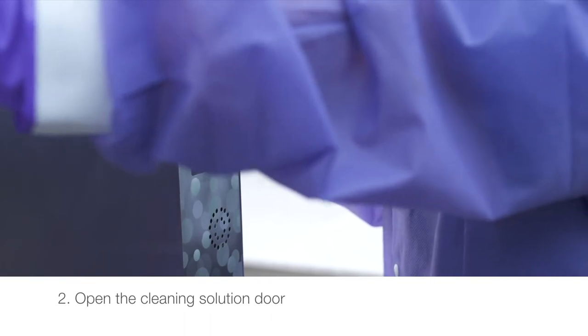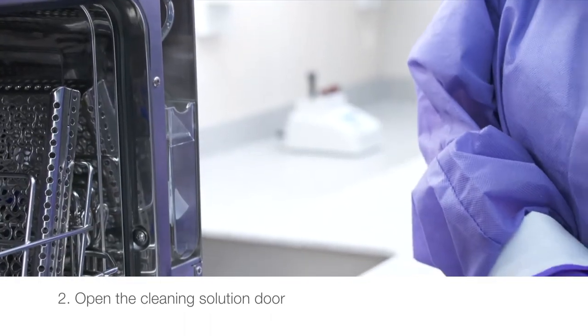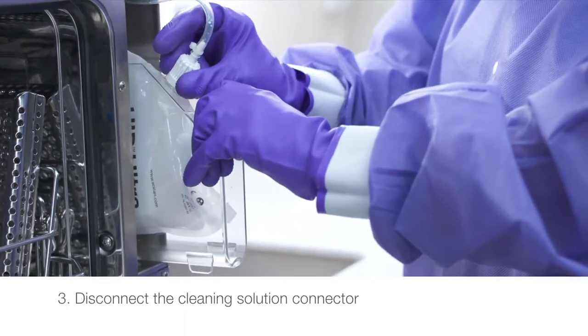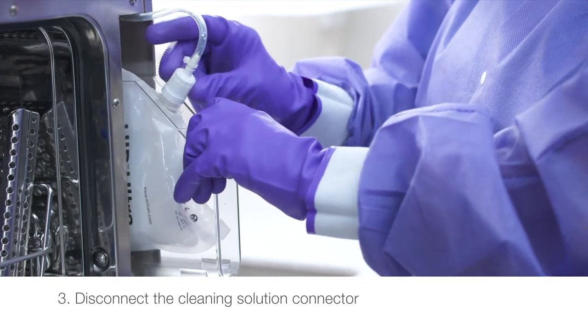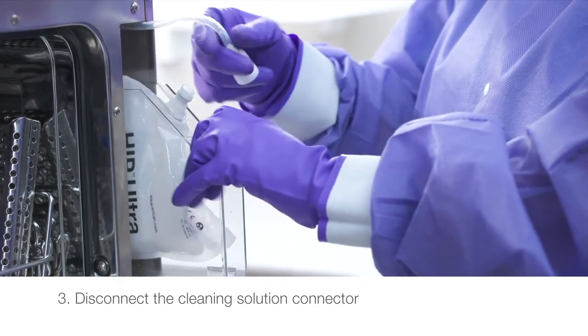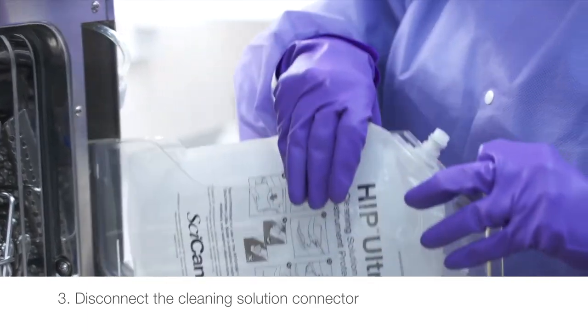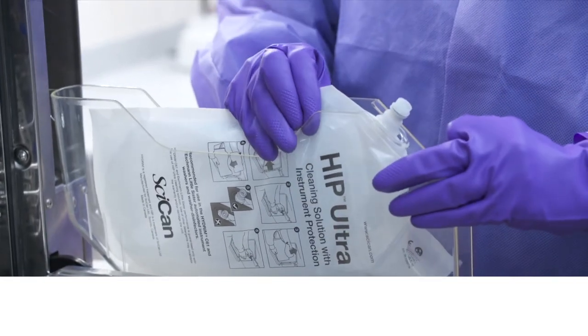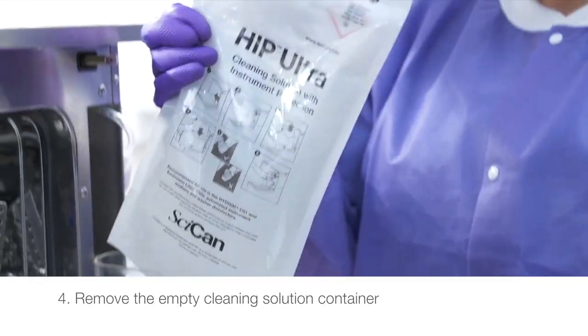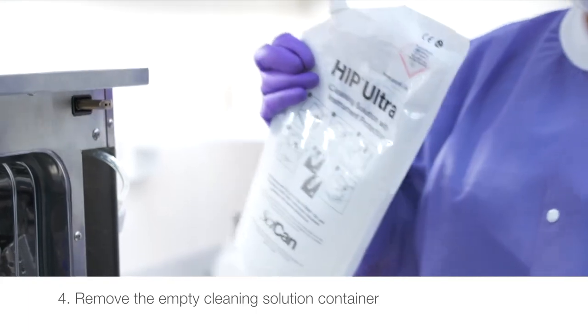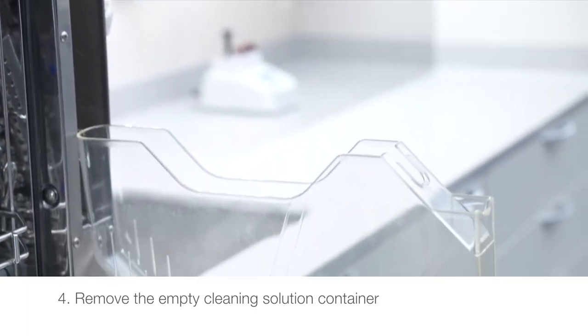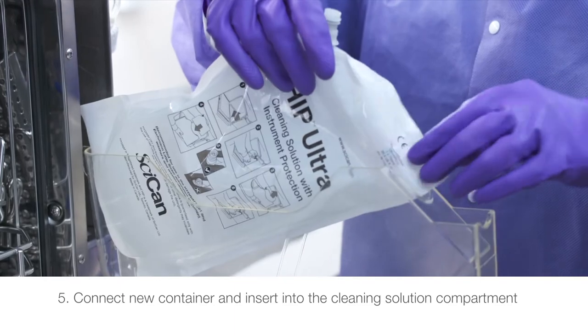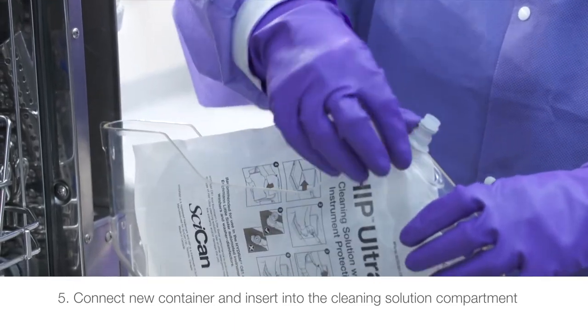Open the cleaning solution door. Disconnect the cleaning solution connector. Remove any dried chemical by immersing the connector in a cup of water. Remove the empty cleaning solution container and discard or recycle. Connect new container and insert into the cleaning solution compartment.